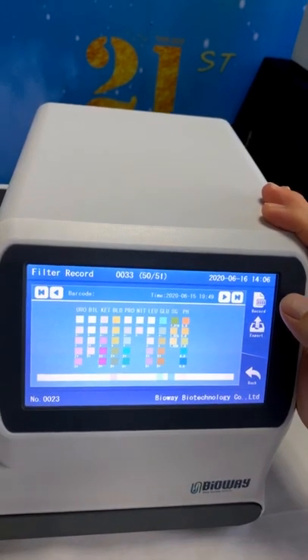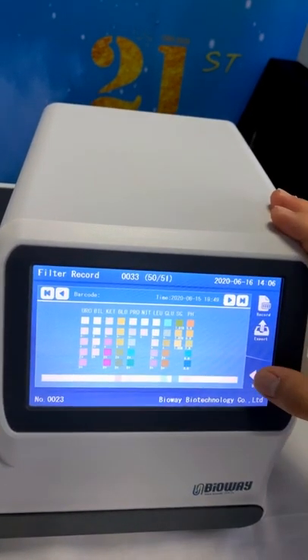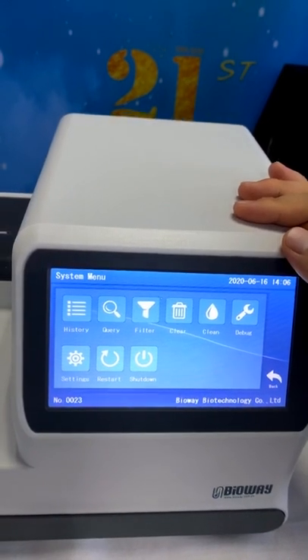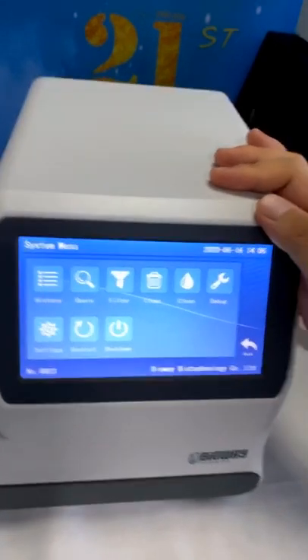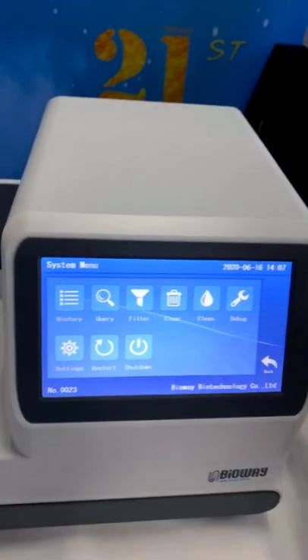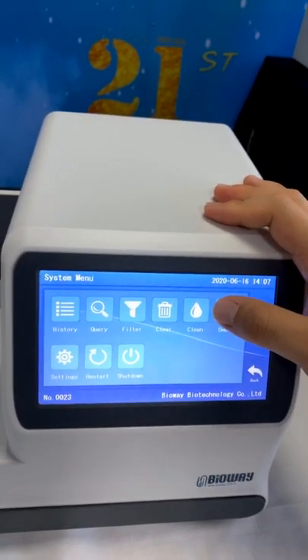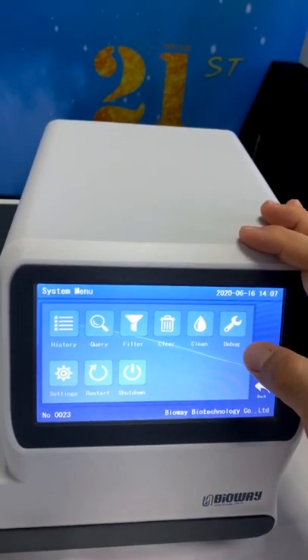You can make a comparison for each item. If you want to delete all the records, you can click clear, but I suggest you do not unless the record is too much. Why? Because the memory has no space, you have to delete some unnecessary data, right? And this device also has the clean function to achieve. It will clean itself.